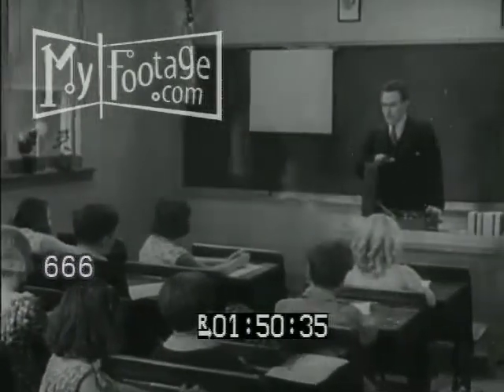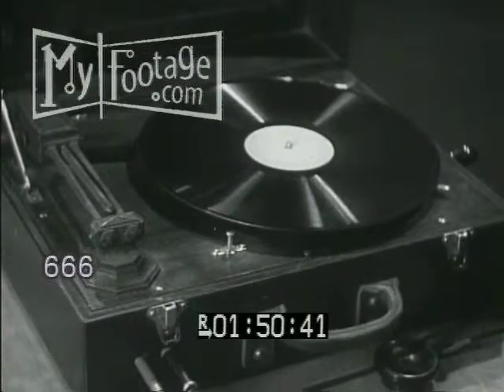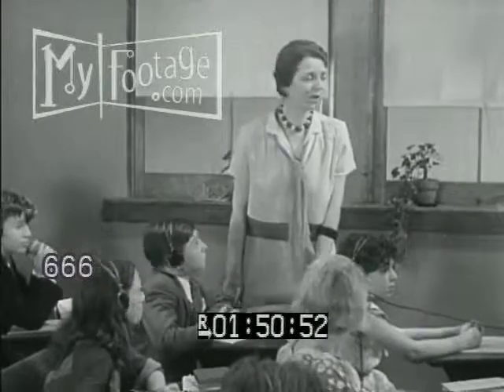This apparatus, known as an audiometer, is used to measure the powers of hearing. By its use, we can tell whether or not your ears are properly doing their work of transmitting sound. Now take your pencil and paper and write down the words that you hear through your earphones. Whenever you're ready — I think they're quite ready, Mr. Brooks.